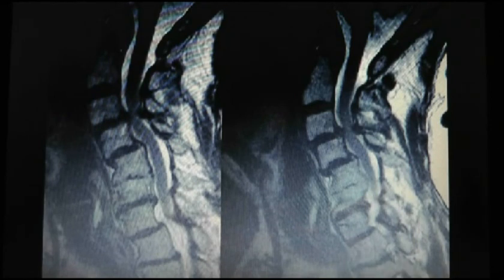Well, you can take the choice of constructing an anterior cervical fusion, C3 to T1. That's pretty big, isn't it? And why do you want to go down to T1? Because of the spondylolisthesis. So how about if we stop at 7? Then it'll break down faster at C7-T1. So you'd be worried that C7-T1 will continue to deteriorate.